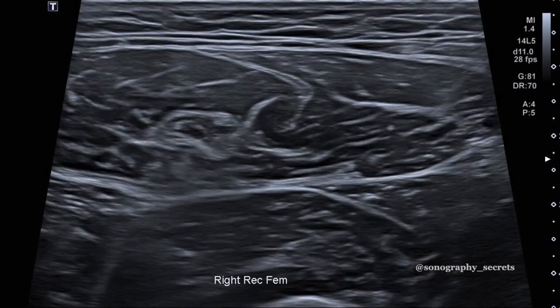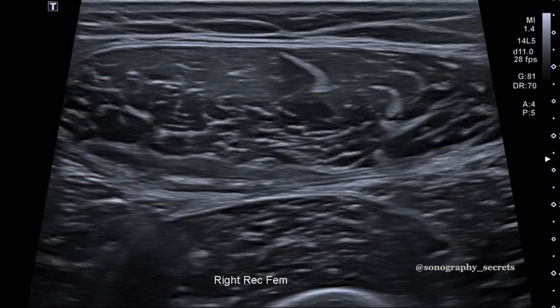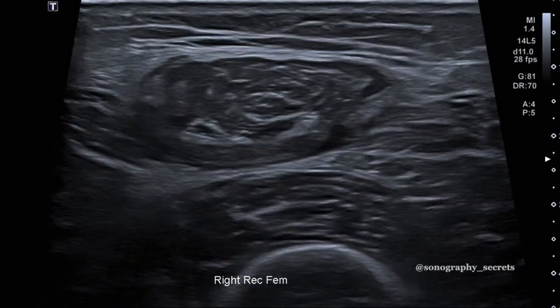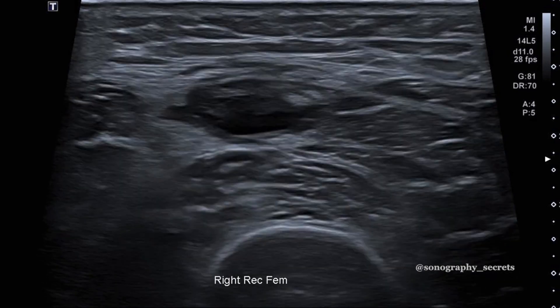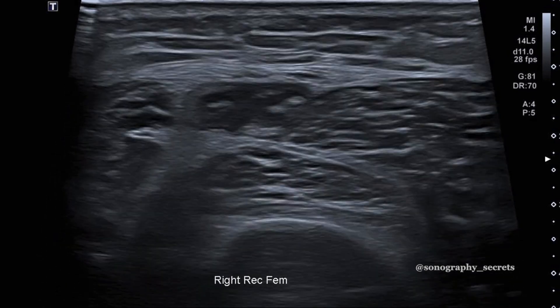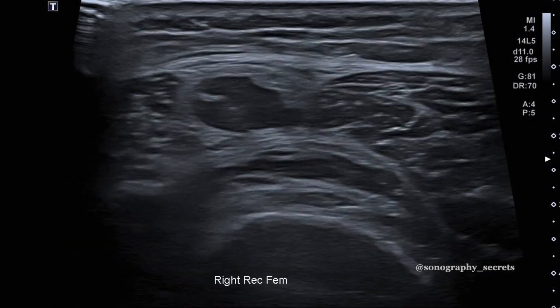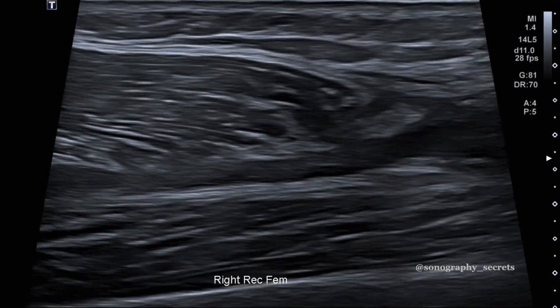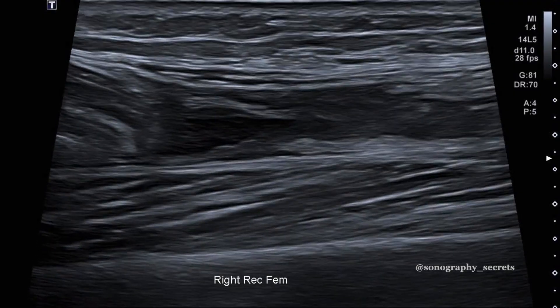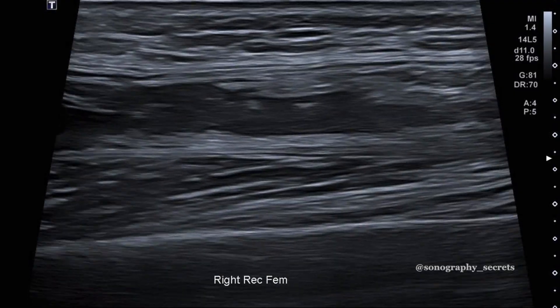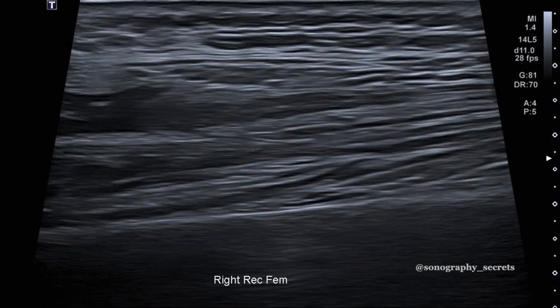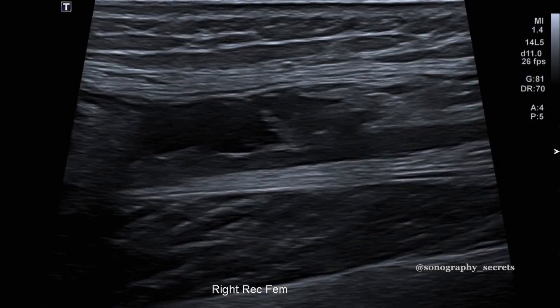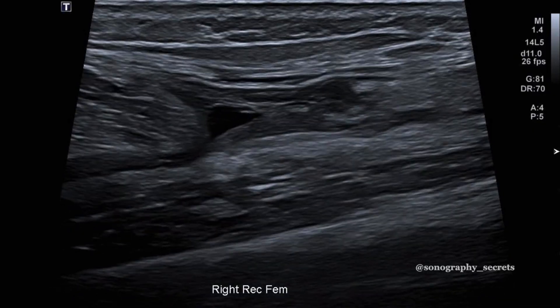Here is a distal musculotendinous junction injury of rectus femoris — post kicking, we see abnormality of the posterior aspect of the muscle, that is an MTJ tear with a complete tear of the distal tendon of rectus femoris. In long we see the same, and note that the abnormality is not located at the distal end of the central indirect tendon, which is a common misconception. With flexion of the quad we can see some bull-nosing of the proximal muscle of rectus femoris, helping to demonstrate a complete tear.